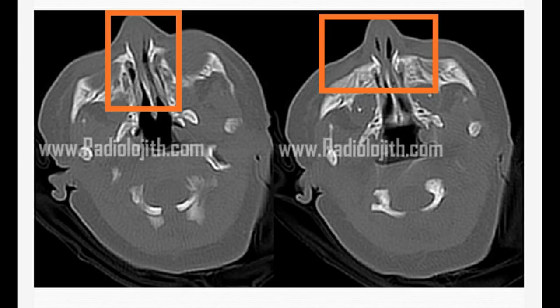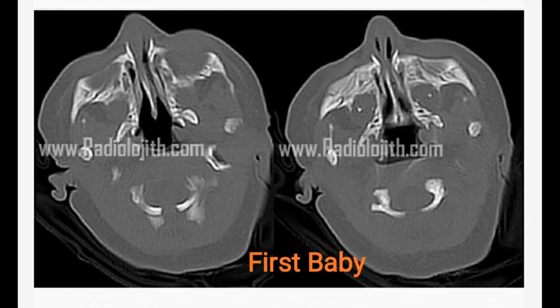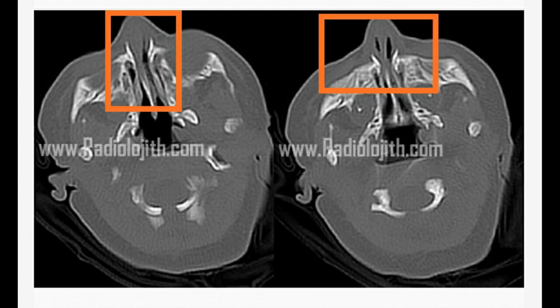The first one shows significant narrowing of the anterior nasal process with overgrowth and narrowing of the anterior pyriform aperture, more on the right side. The posterior choana appears patent with no narrowing. The vomer appears normal. The diagnosis is congenital pyriform aperture stenosis bilaterally, more severe on the right.